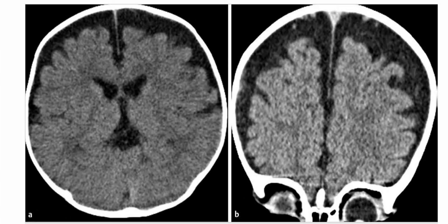So this is an 8-month-old boy who presented with enlarged head circumference. This is the axial CT scan, and it shows symmetric extra-axial CSF attenuation fluid collections which are overlying the frontal lobes. The reformatted coronal CT image reveals the bifrontal extra-axial collection with vessels which are traversing through the fluid, which is indicating enlargement of the subarachnoid space rather than subdural collections.